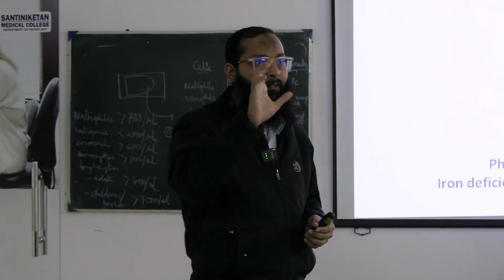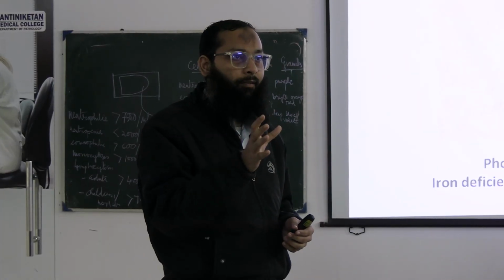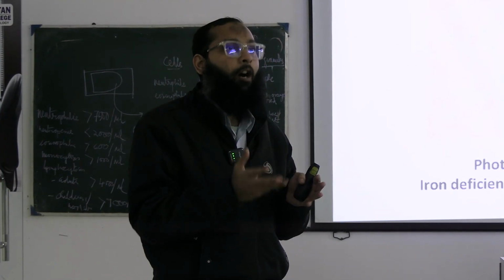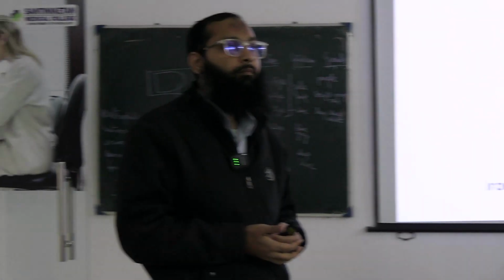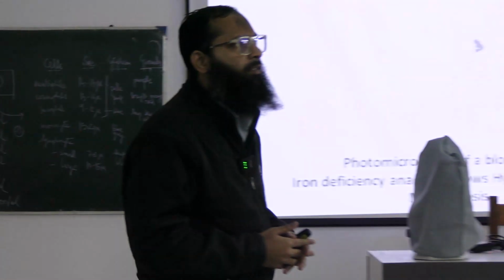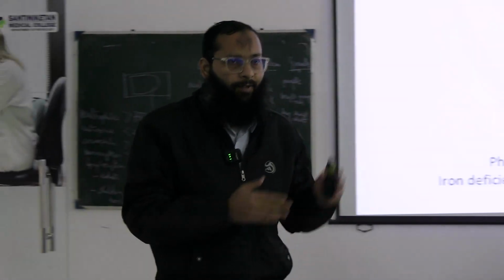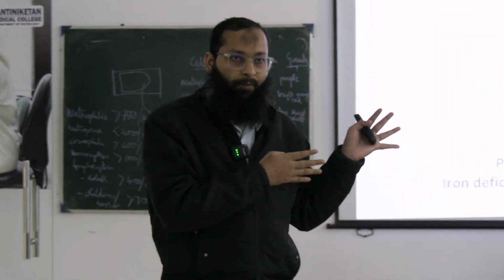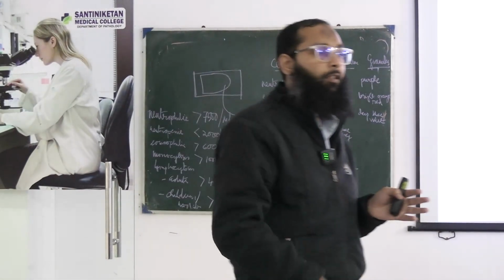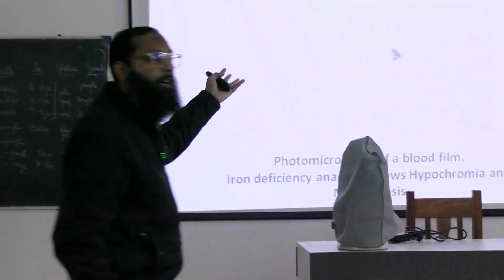There must be something by which you can compare, just like the size. For hypochromasia, how will you compare? MCHC, that is a different thing. We are discussing here the peripheral blood smear finding. You are not wrong, but in the PBS, how will you compare?